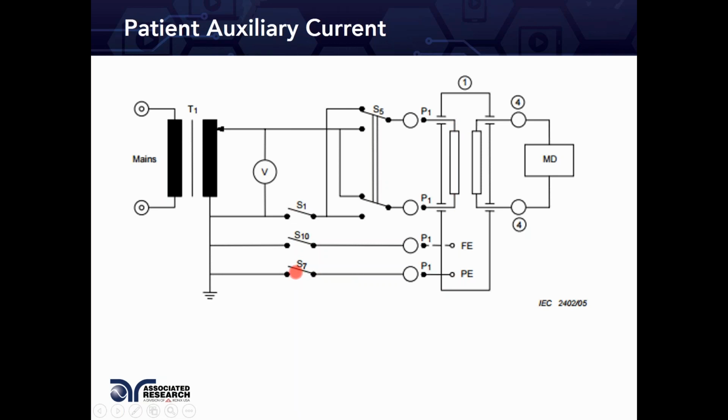The scenarios again are similar to switch 7, 10, and 1 or S5. You're actually simulating different kinds of switch conditions or single fault conditions.